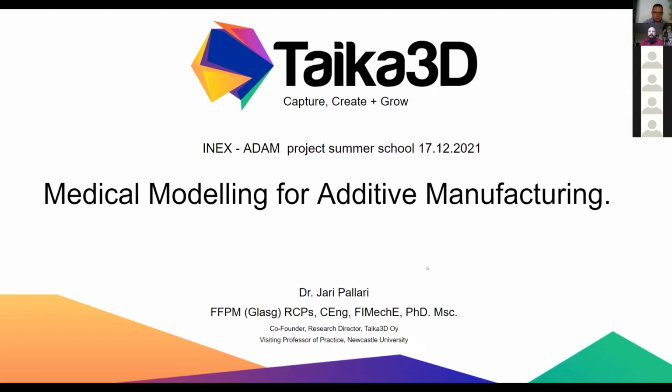I think here you can find a lot of similarities with other related industries in the medical field and 3D printing. One of the key issues in really utilizing the potential that 3D printing has in the field and really adding value to the patient and to the companies in the field is that you have to be able to scale the design process up.